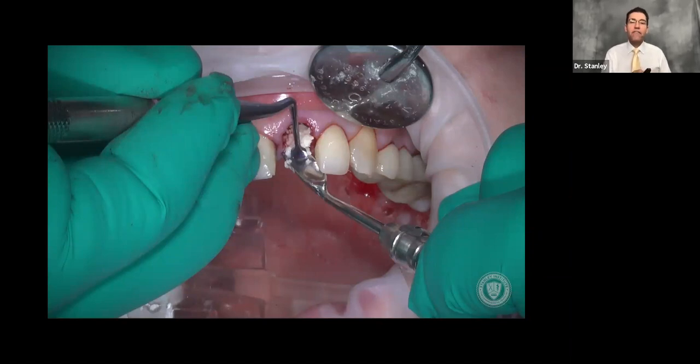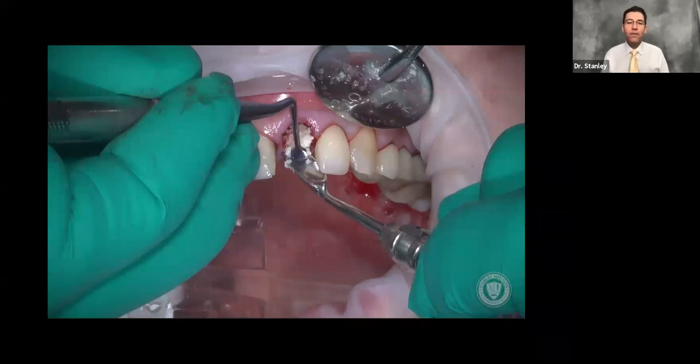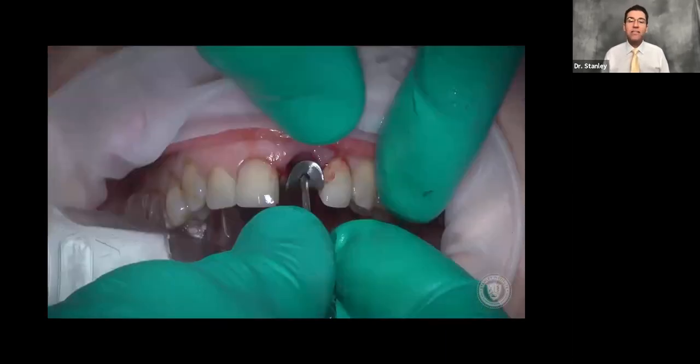I tap it down really lightly, wiggling the bone particles to get them to fit in place, but not compressing them too firmly. I want space for blood to flow around them to create a nice blood clot — I don't want it too tight, just full. At that point, we can retrieve the healing cap; it's already done its job of preventing bone particles from going into the implant hole.